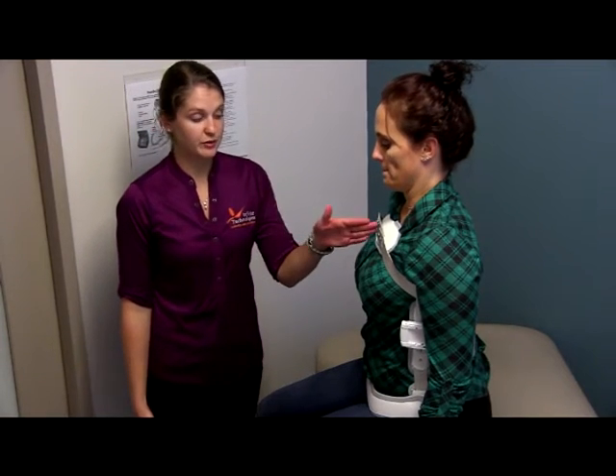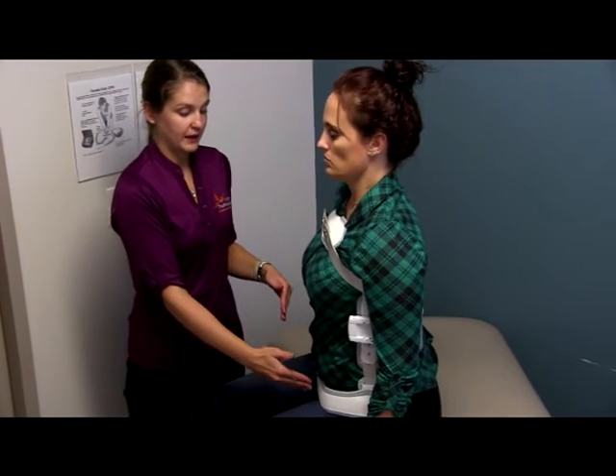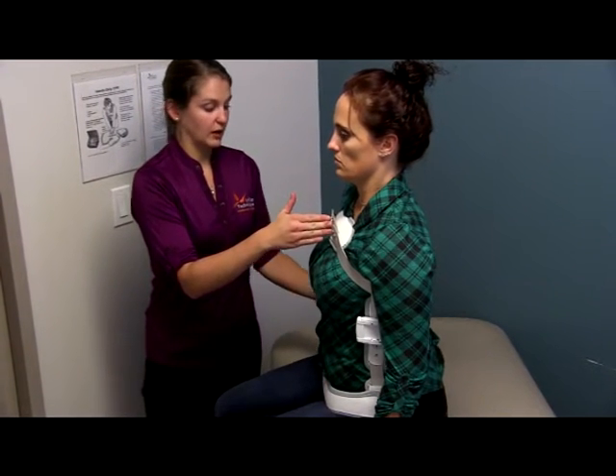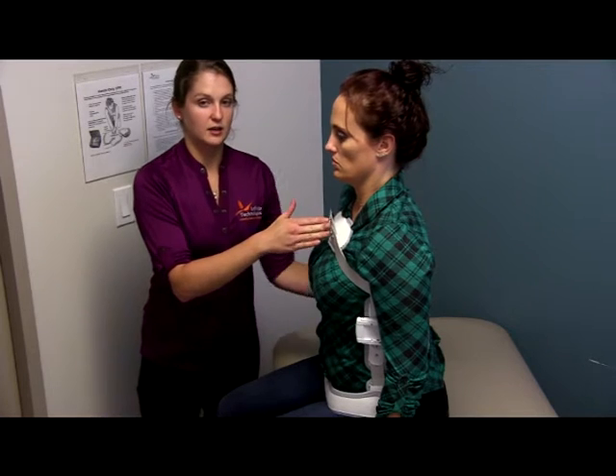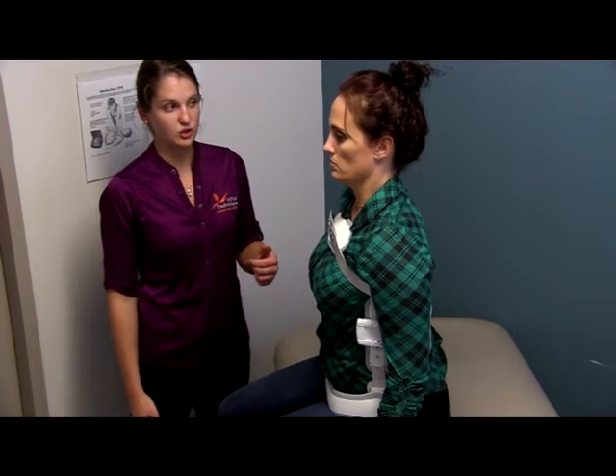This brace works off of a three-point pressure system, applying pressure at the chest level and the hips, forcing the patient backwards and pulling the spine in at the middle of the back to hyperextend the spine, keeping the spine in a straight alignment.